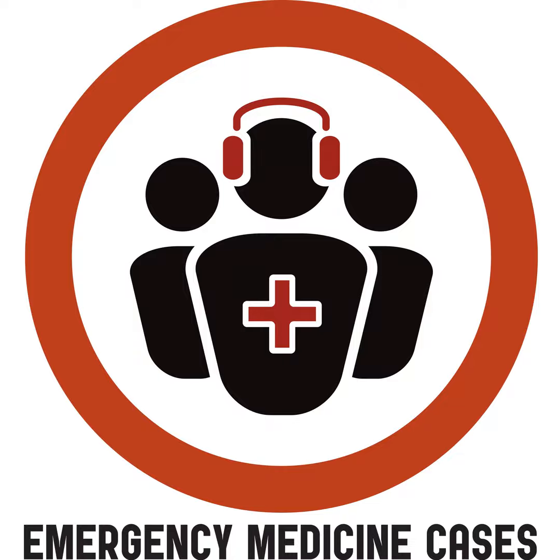So hopefully that helps to tease out the concept of central ray and why it's important to know. And to add to that, I'll tell you, there's little small things that I think make a difference. Like if somebody has injured their toe, don't do a foot X-ray, do a toe X-ray, because when you do a foot X-ray, as Dr. Chadha is saying, the beam is centered on the midfoot. But if you're worried about the toe, you want the beam centered at the toe.